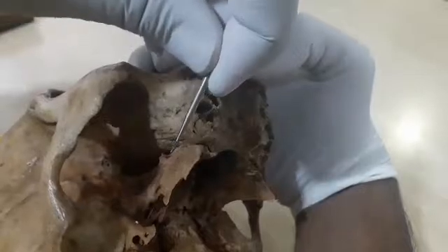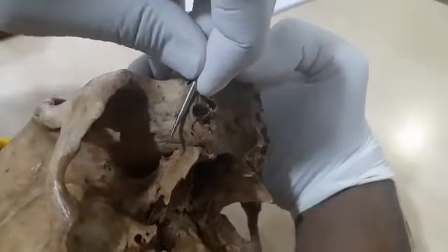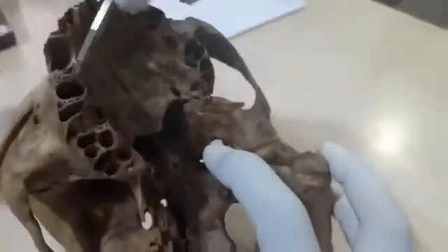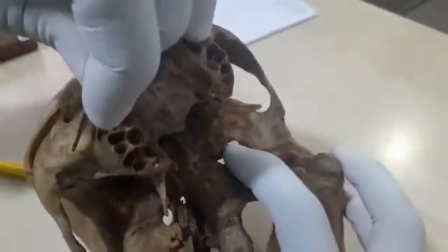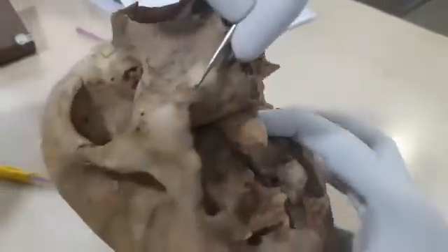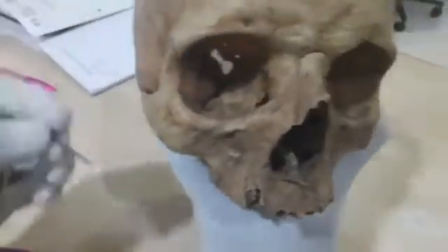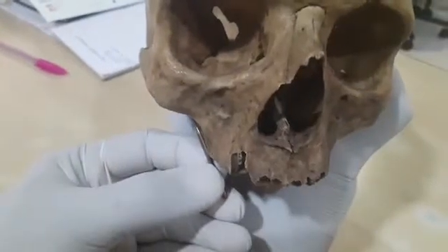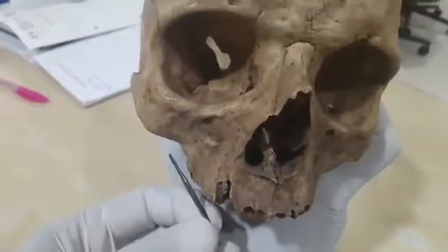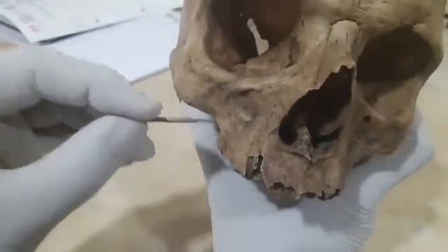This is the perfect angulation. This is the first implant for double pterygoid, and this is the second implant — and not like this. If you are planning for the pterygoid buttress, then you should go like this: insert here and come till here, in this region. So your implant would stay like this in the buttress. If you are planning for pterygoid, then your implant should insert from here and come out here.